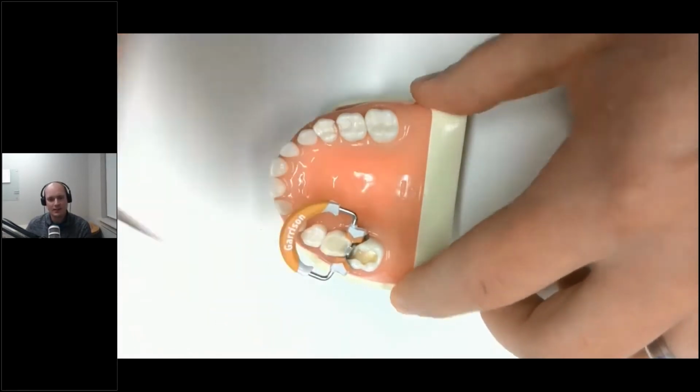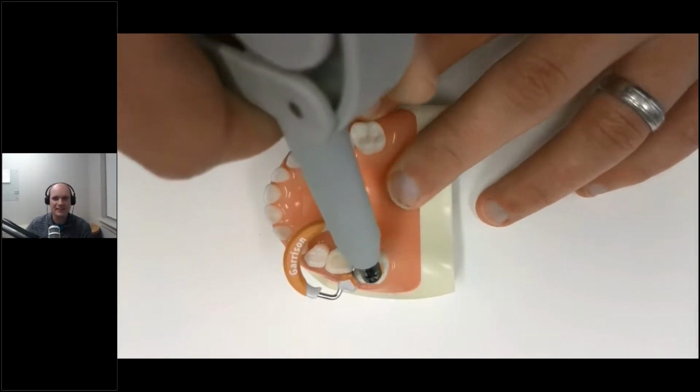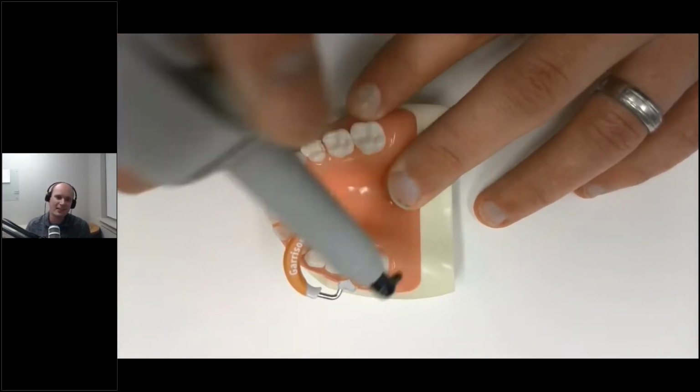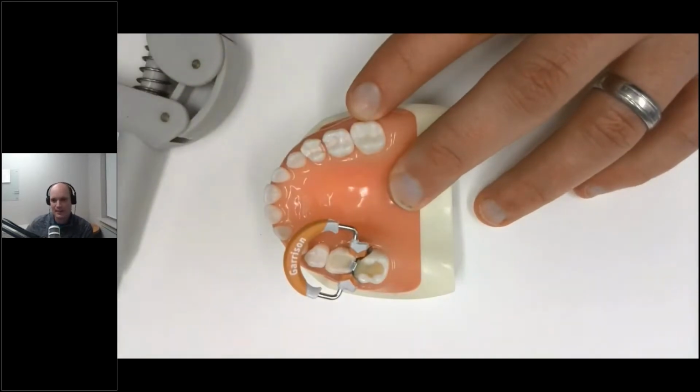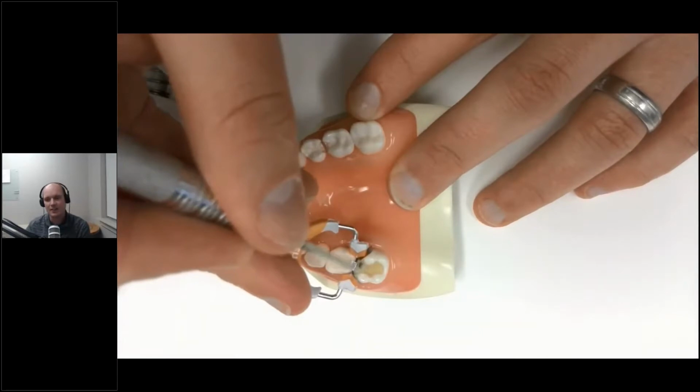But a very nice way, especially for kids that don't have access to the endodontist, to do this, you know, calcium silicate MTA, pulpotomy, direct pulp cap kind of thing, and just reduce their need to see the endo. And I'll show you some cases.